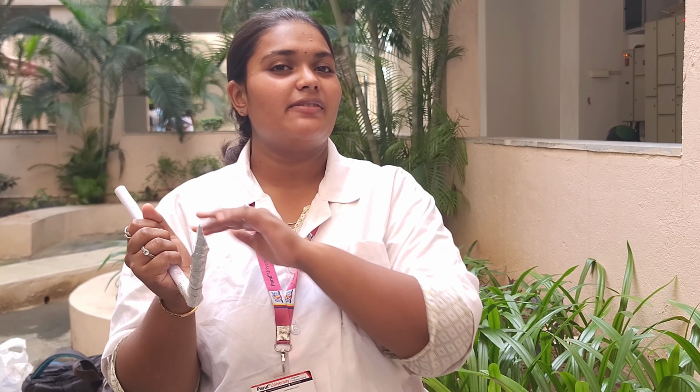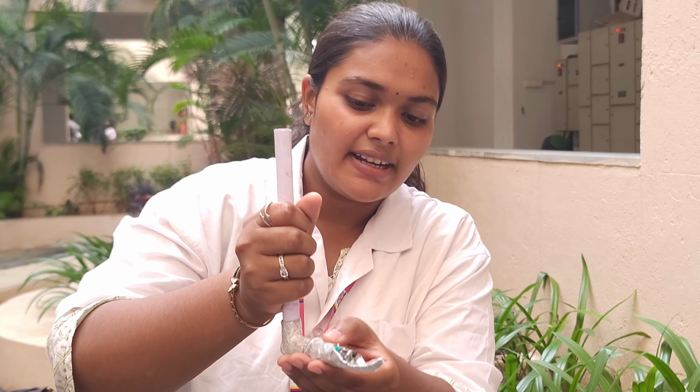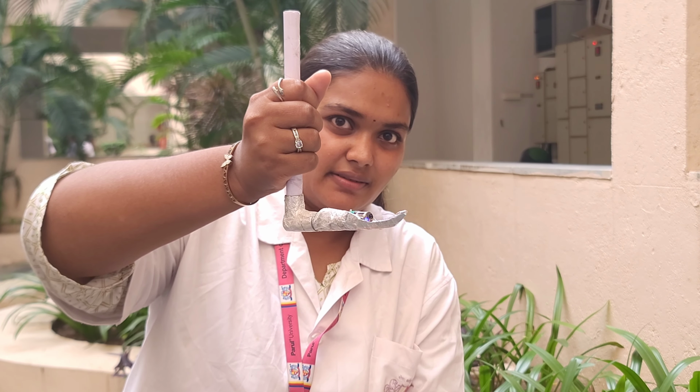Hold the scope with your dominant hand, whichever way you are comfortable. Usually it is held in the left hand, but I'm comfortable with the right hand, so I'm going to hold it in the right hand. It is inserted in your mouth from here, like this, and the light is switched on. Like this, it is inserted. This is the continuous process of intubation.